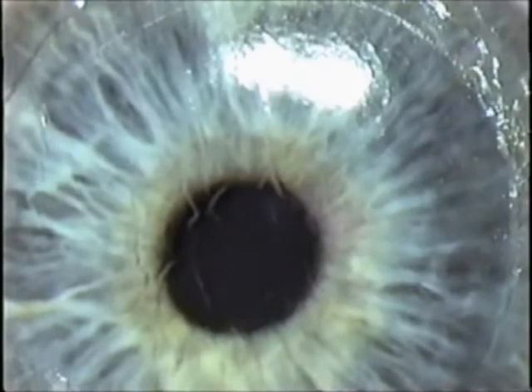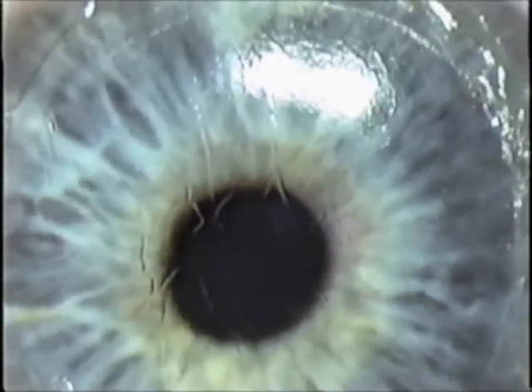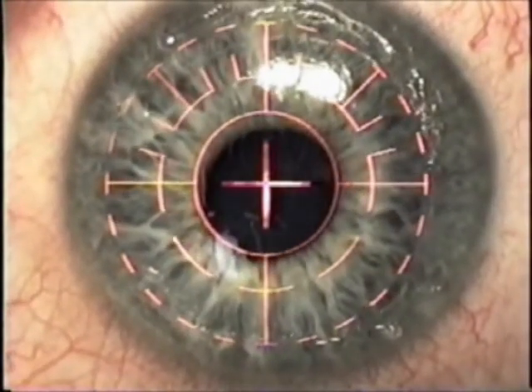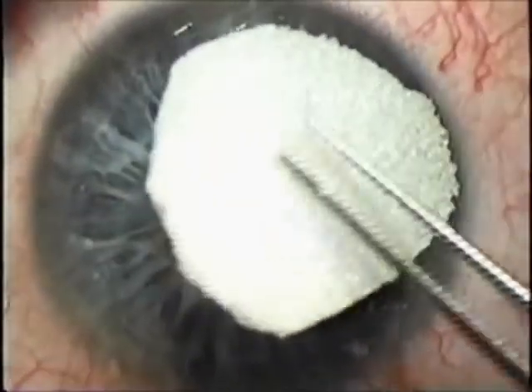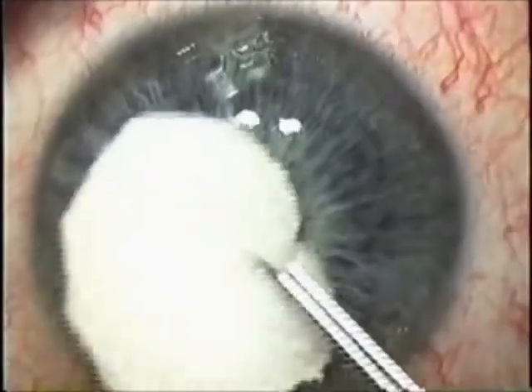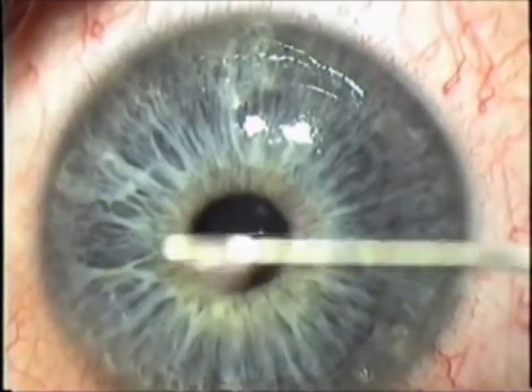In cases of superficial previous LASIK flap abnormalities like flap wrinkles, a myopic laser profile can be used for flattening along with Mitomycin C for excellent visual and refractive outcomes.